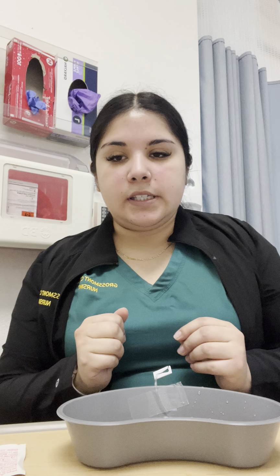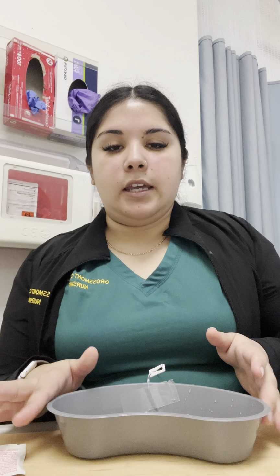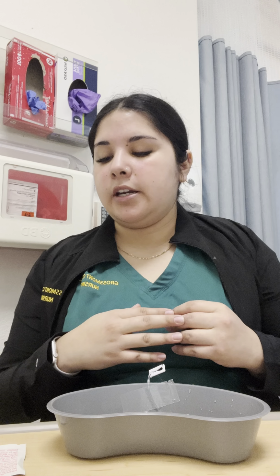Having done my first and second checks in the Pyxis and the medication room respectively, I have drawn up my medication. The order calls for 1 ml to be administered, and using my drug guide as a resource, 1 ml should be pushed over 1 minute. So I will be pushing 0.5 mLs every 30 seconds.